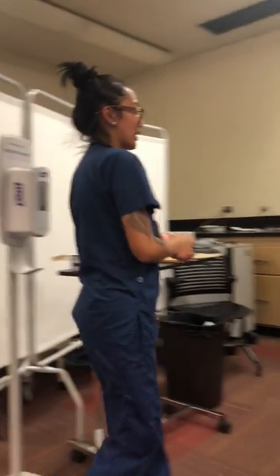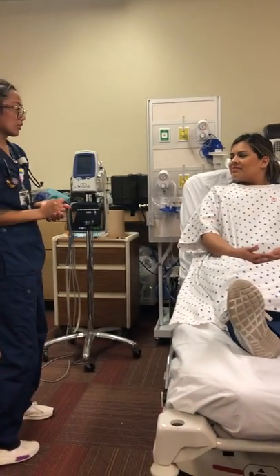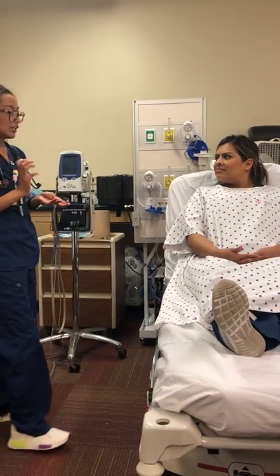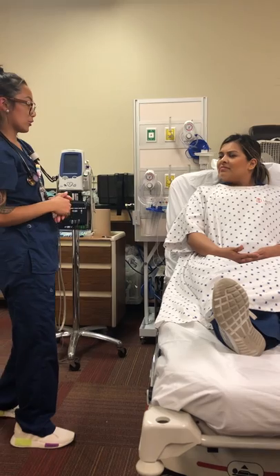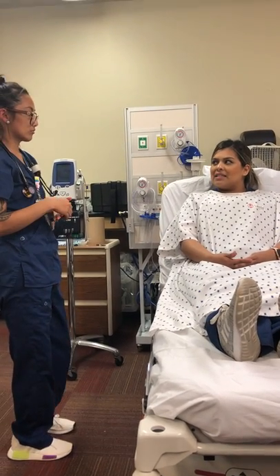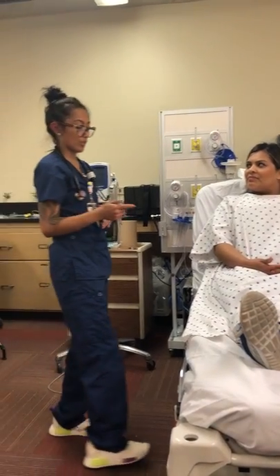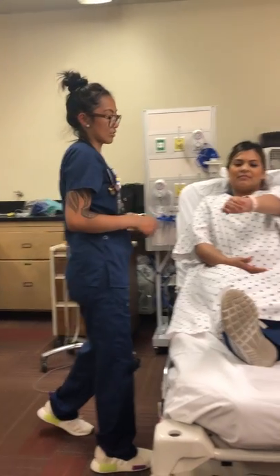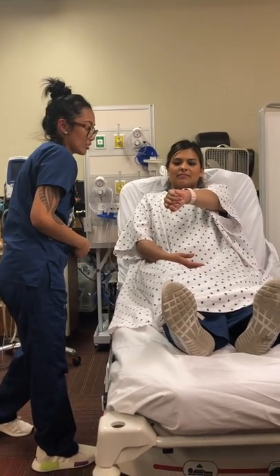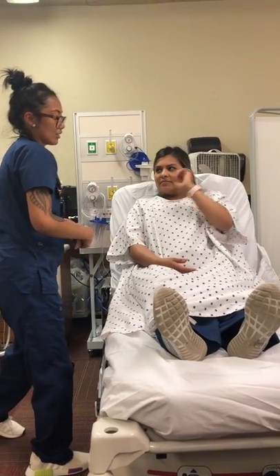Hi, my name is Bernie. I'm from the respiratory department. Can I get your name and your date of birth, please? Yes — Julie Juarez, 6/21/88. Okay, so at this time I'll check her medical band just to make sure it's the correct information. And it is.